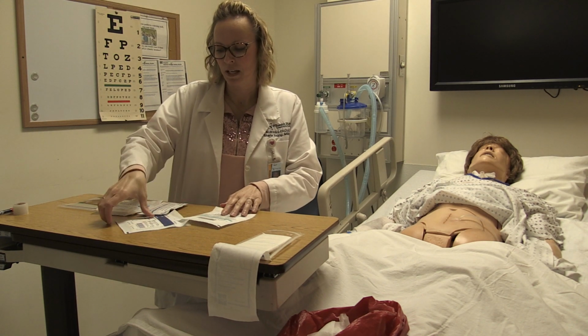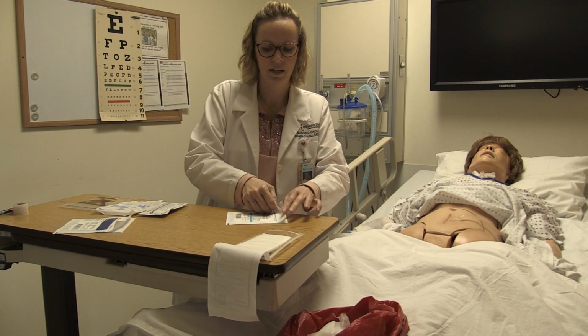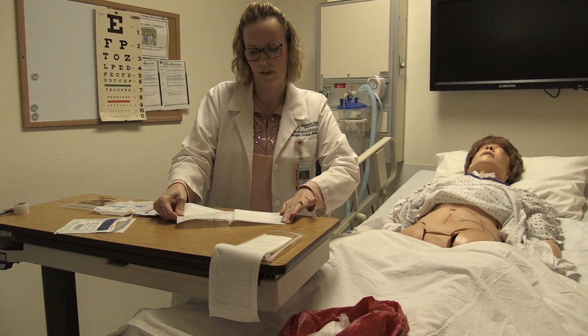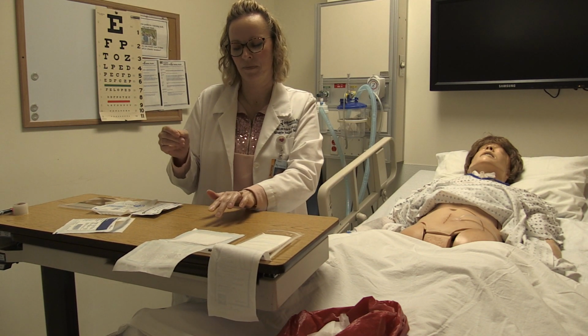And then the next one I have is a gauze sponge. That'll be the next to the last thing I apply. Going to open that up. And then I'm going to move that back here.